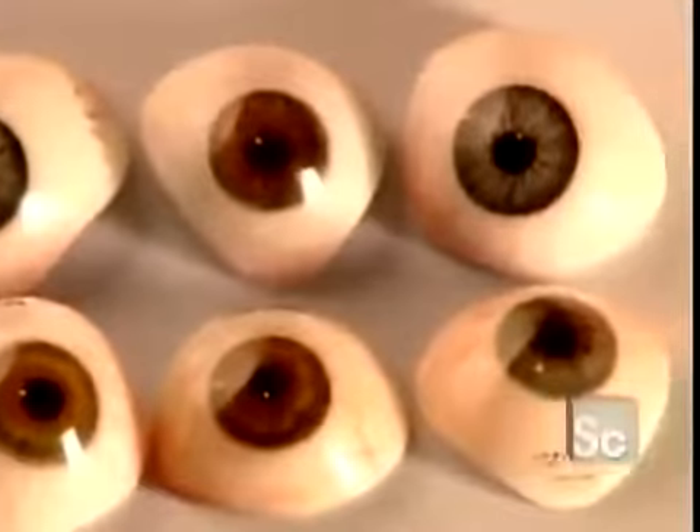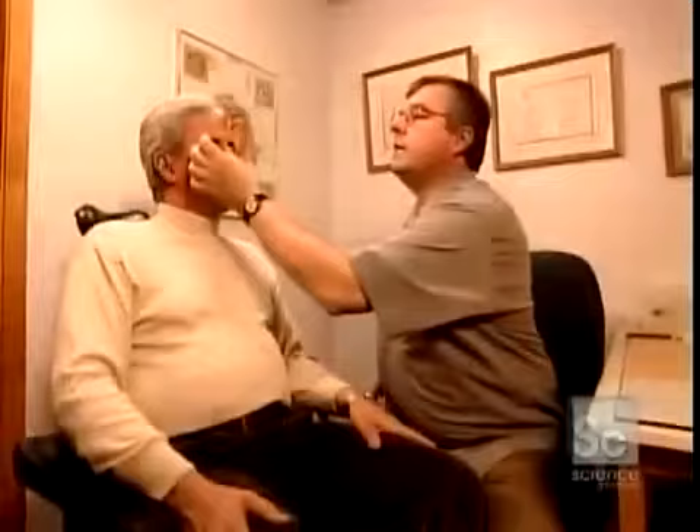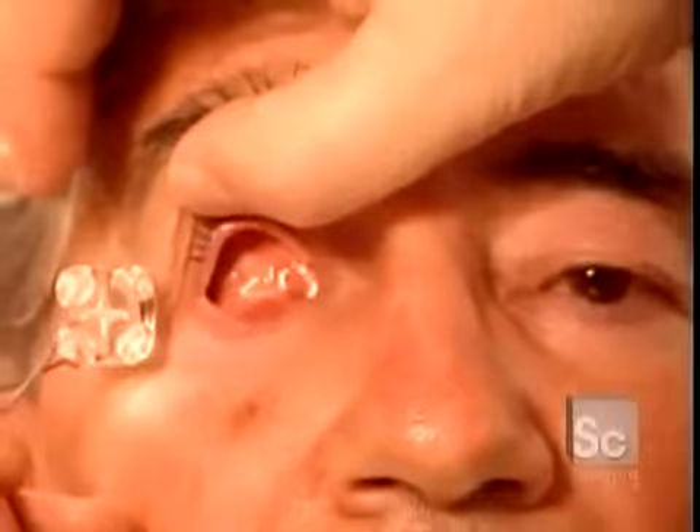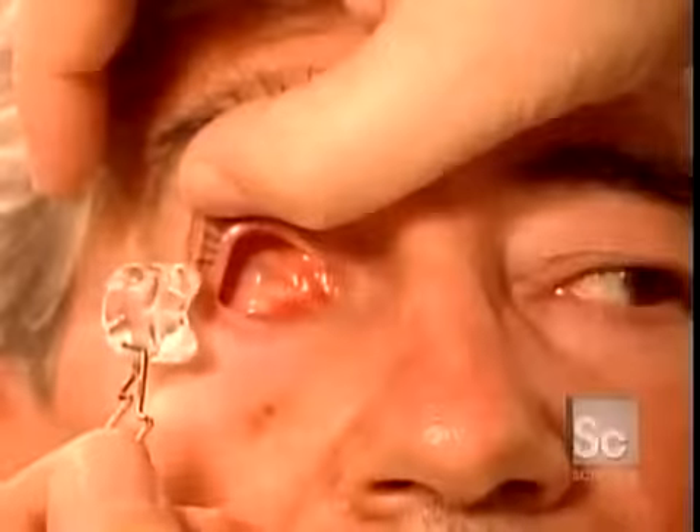If you've lost an eye in an accident or to a disease, a specialist known as an ocularist can fit you with an artificial eye. You can get a ready-made model or a custom-made prosthesis, like the one for which this patient's being fitted.